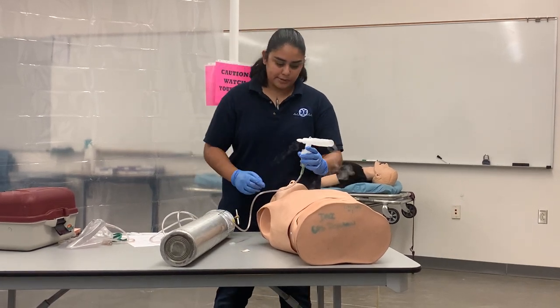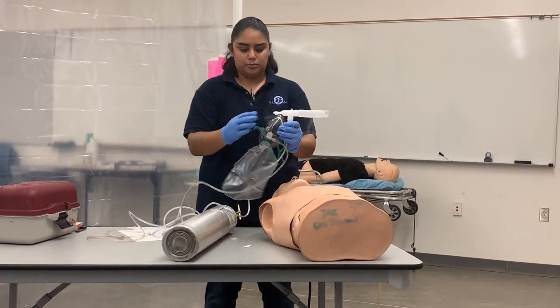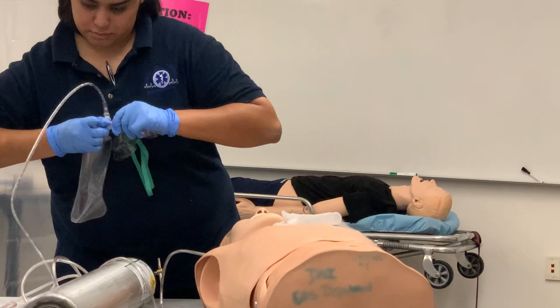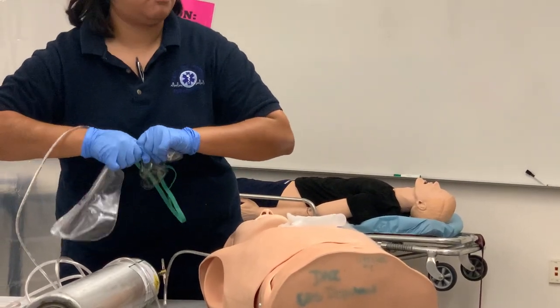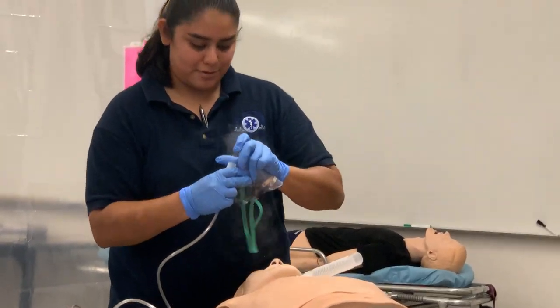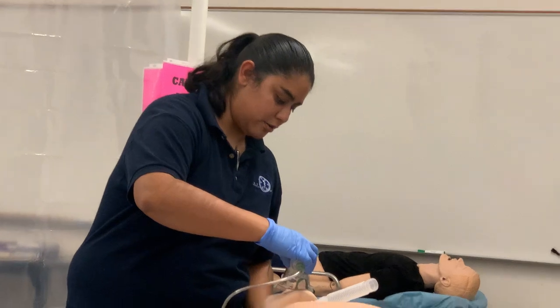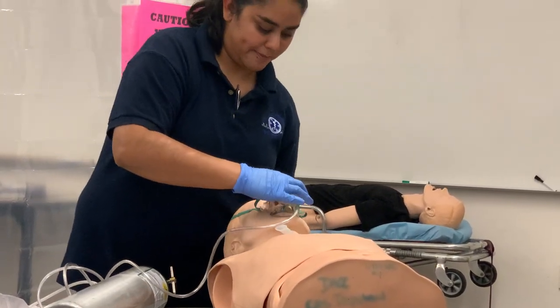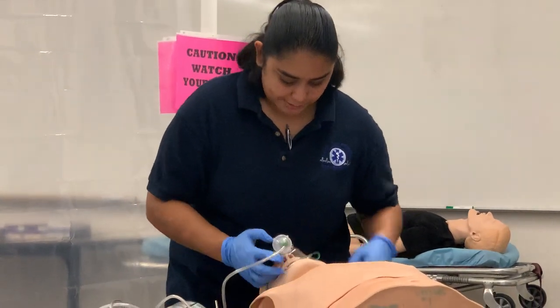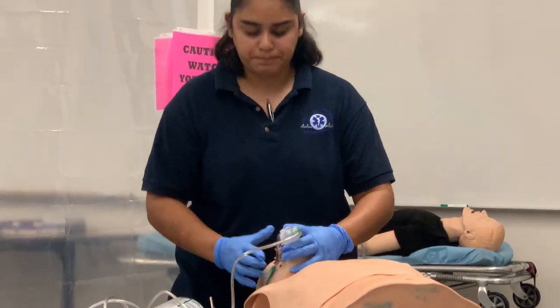What if they can't self-administer? What if they can't hold that? If they cannot hold this, we're going to take a non-rebreather mask and take the bottom part off — it just pulls off. We're going to put this on there, use the mask, put that on the patient, and tighten it down with the straps, making sure you have your nose piece secured.